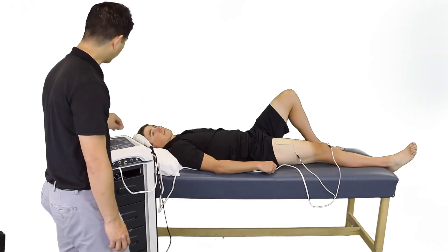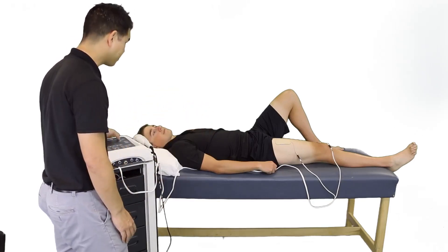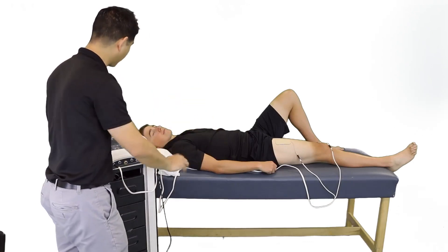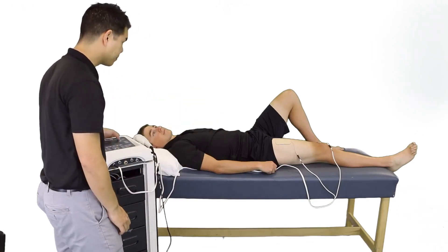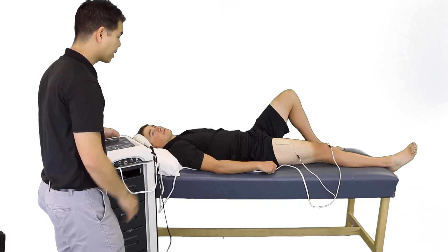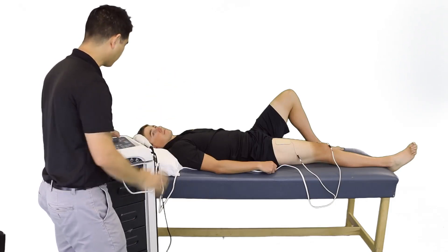Okay Patrick, I'm going to start the unit. You're going to start to feel some tingling — let me know when you begin to feel that. Our goal is to get your knee straight down to the bottom of the table. Start feeling it? Okay, so you're beginning to feel some tingling. We're going to keep ramping it up — we want a strong muscle contraction.